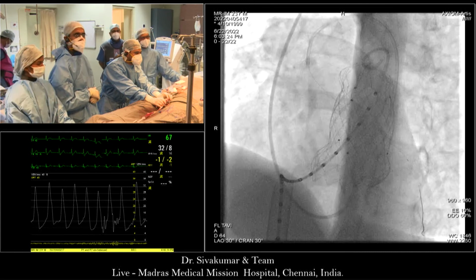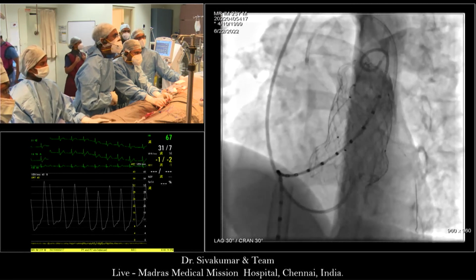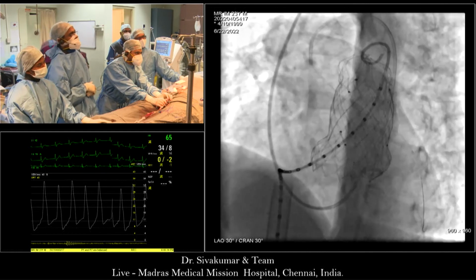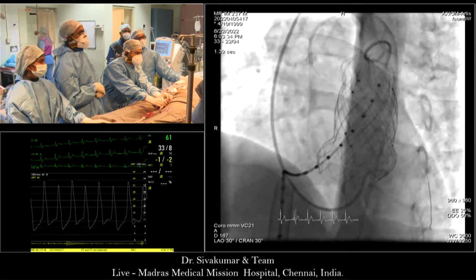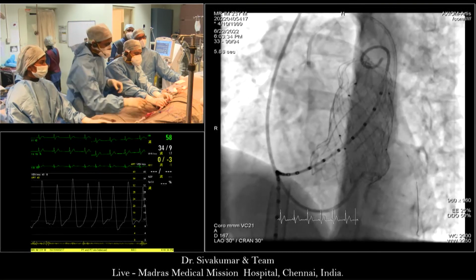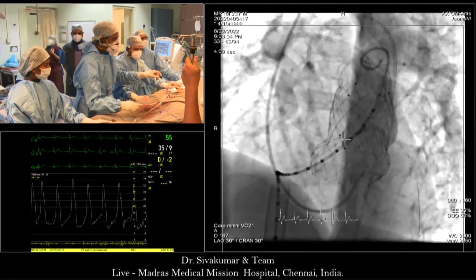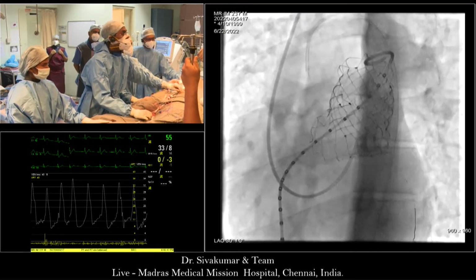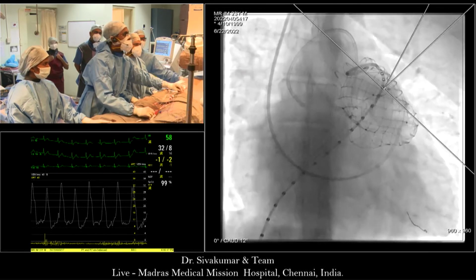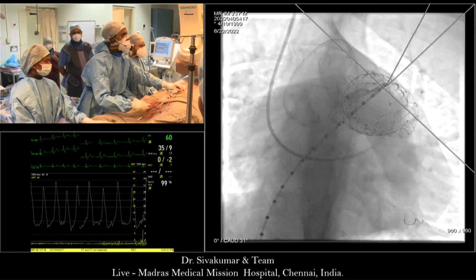Ready? Shoot. The proximal markers are matching the annulus. Now come to AP caudal. Make an en face view of the valve. No, that's enough. Dye is enough. En face. Correct. I want that picture.